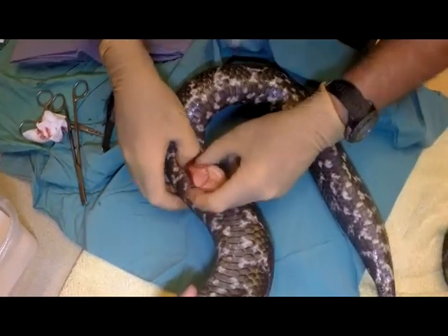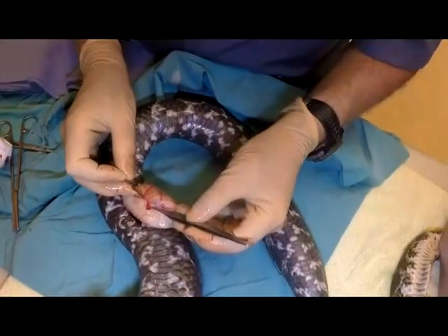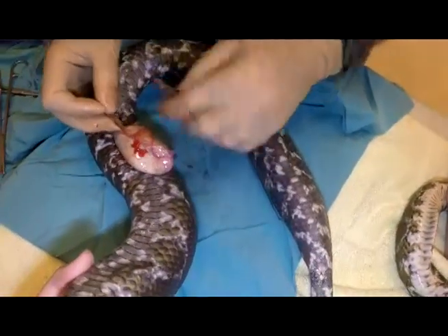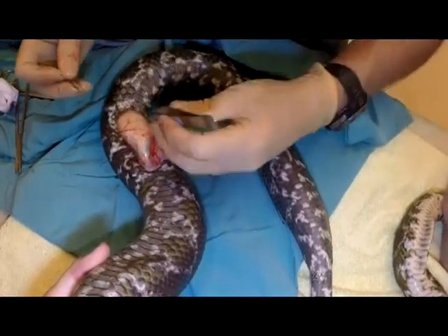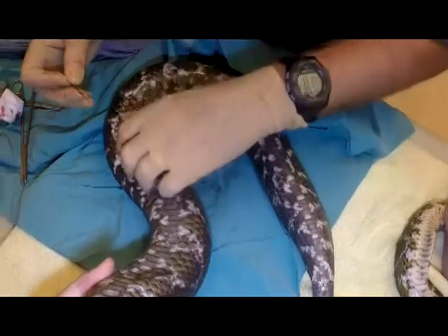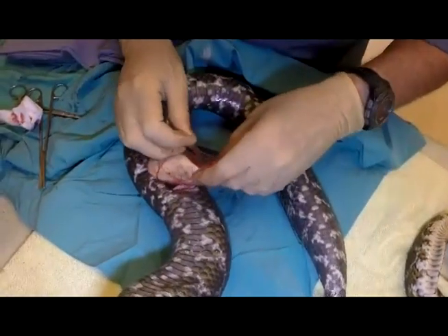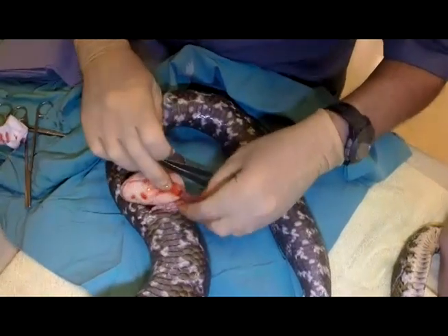At this point, there was no good way to know whether these eggs are viable or not. She had been not at her ideal conditions for some time now, and so there was some speculation, or some concerns with regard to the viability. Nonetheless, the procedure seemed like a very reasonable thing to do, to be able to bring the eggs out and be able to incubate them afterwards.